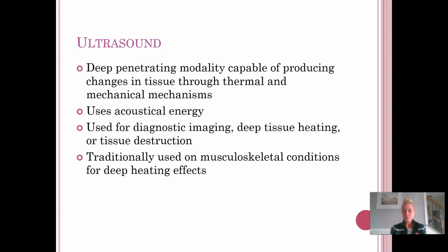Ultrasound uses acoustical energy, which means sound. It takes sound waves and converts it into heat or, again, these other mechanical changes that can happen underneath the surface. When most people think of ultrasound, they think of diagnostic imaging. They think of the pregnant mom going in to see the picture of her baby. And it's the same sort of technology that we use for our ultrasound. We just don't see any pictures with ours.